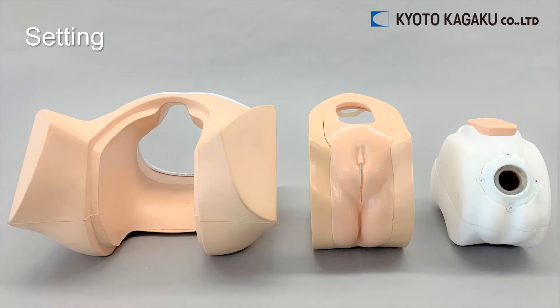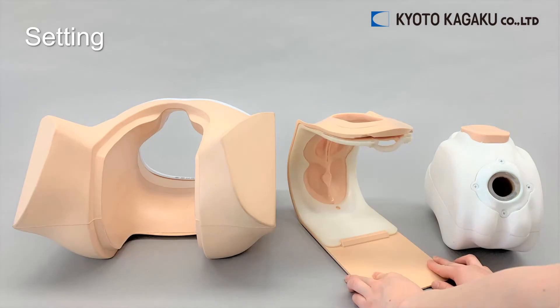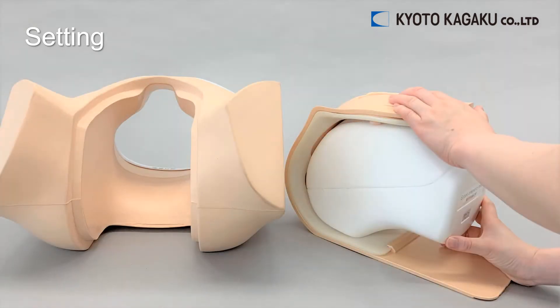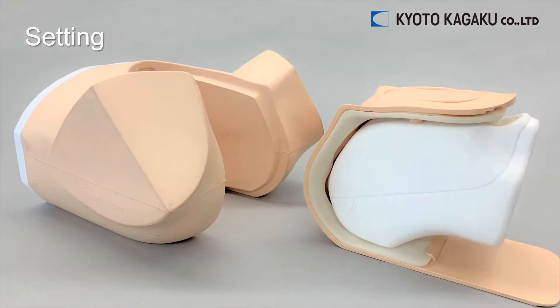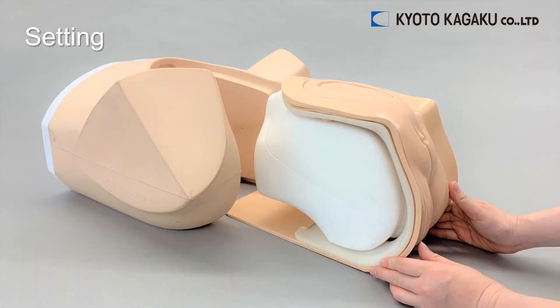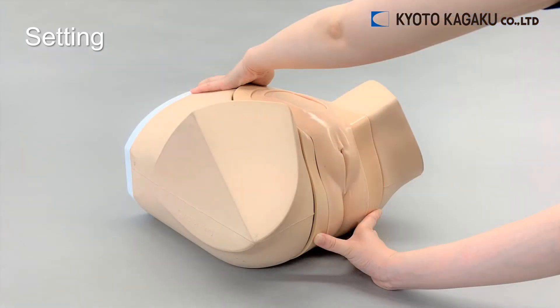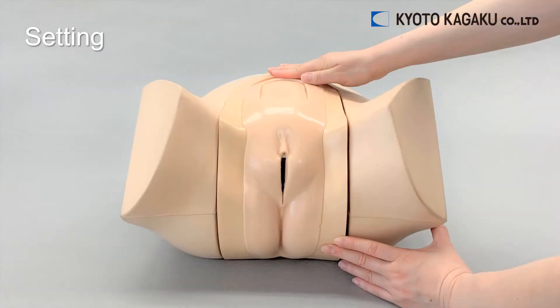This phantom is very easy to use. First, put the unit into the skin frame. Next, insert the unit into the lower torso mannequin. Fix the details, then fix the appearance.